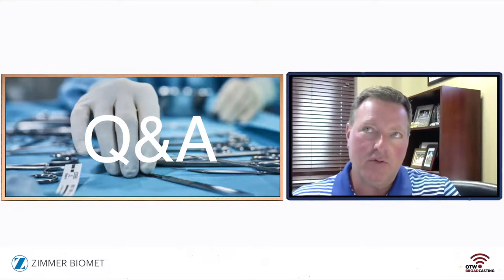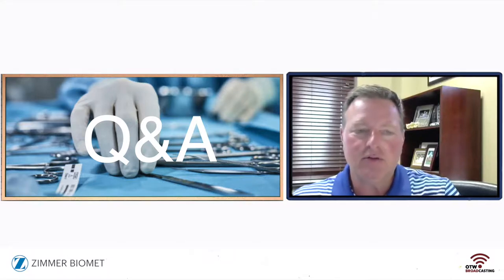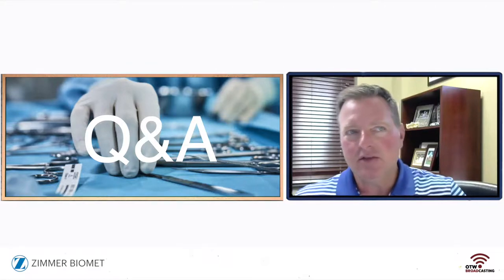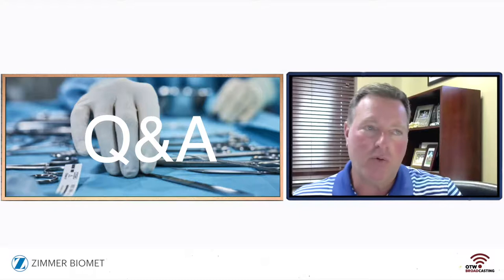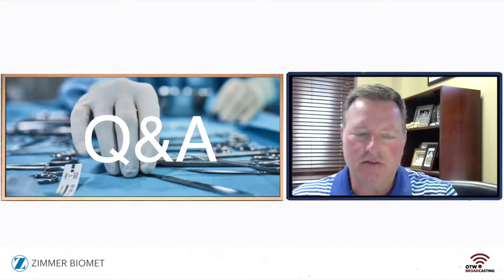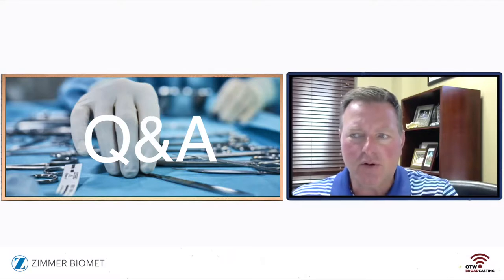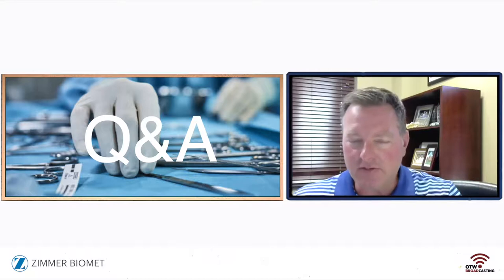And so we tend to measure Cobb angles. As a study group, we're trying to look at whether something is an ideal, satisfactory, or poor outcome when we look at successes. From the patient's perspective, what means the most to them? Is it cosmesis? Is it their flexibility?